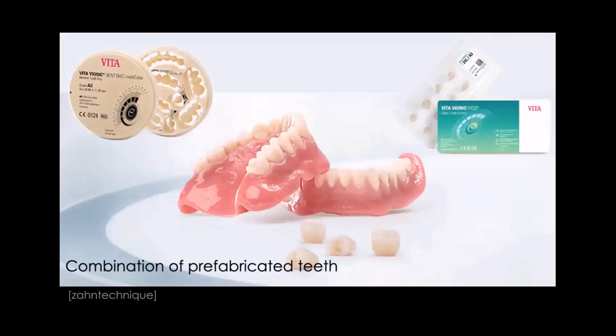And then we have this year, I think you also tried this as well. Yes, we have tried this. So we have combination of prefabricated teeth. They come in blocks, and basically you can then bond them or cement them into the denture base, or you can actually use acrylic even. So the bonding is better between the teeth and the acrylic. And I believe since I've been at Zahn Technique, we have received way more digital dental cases, and it's progressively getting more and more as we go. Yeah. So I think the digital future of removable dentistry is definitely big.